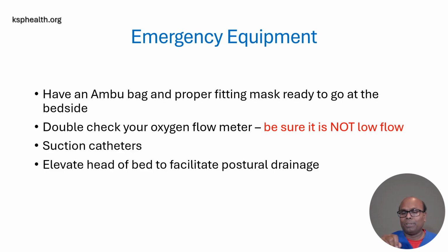Number 2, the most important thing, make sure the oxygen flow meter is not low flow. It has to be a high flow meter, accessible and ready to go. Make sure suction catheters are there and in working condition. Elevate the head of the bed to facilitate postural drainage.